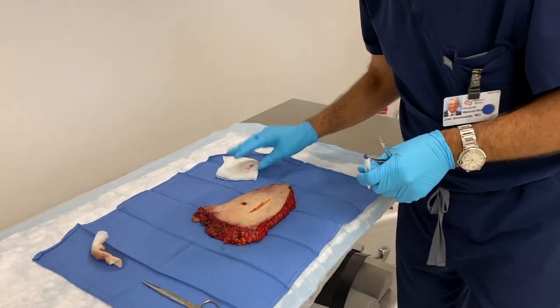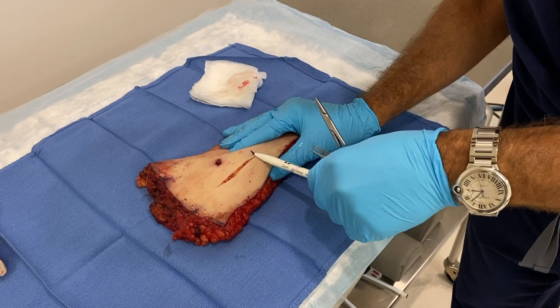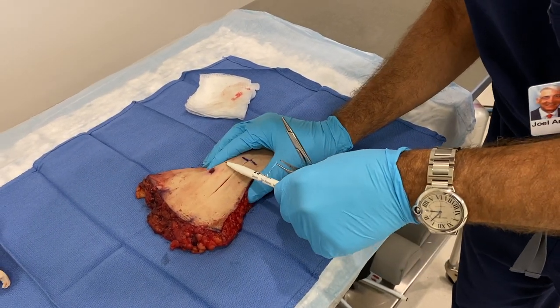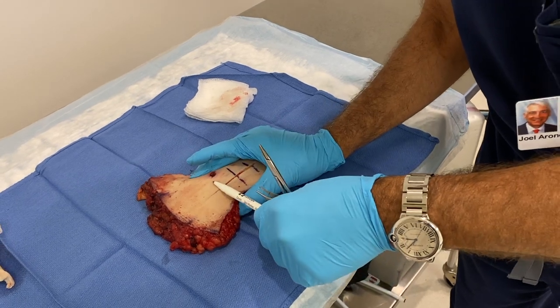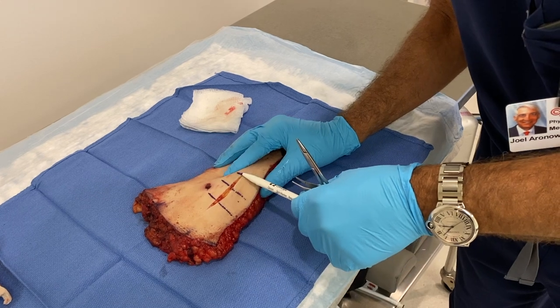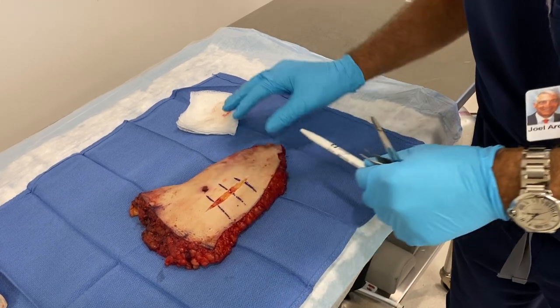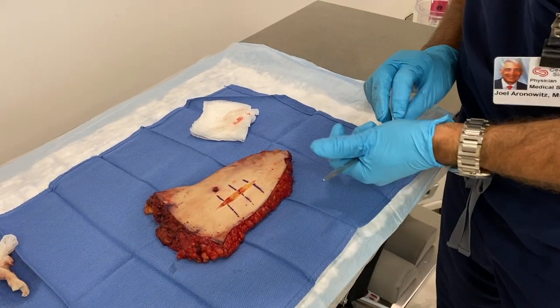So step one, we made the incision. Sometimes it's helpful when we're practicing to create little hash marks that line up the skin edges properly. When we're a little more advanced, we probably don't need to make these hash marks.